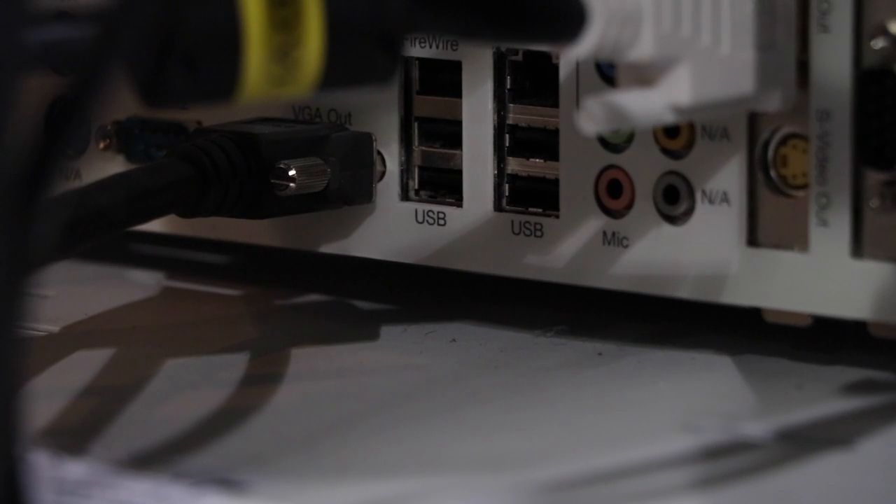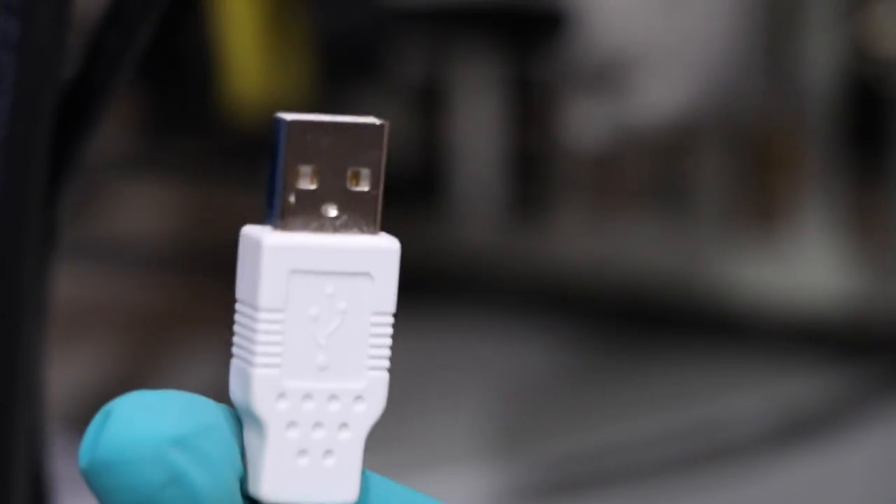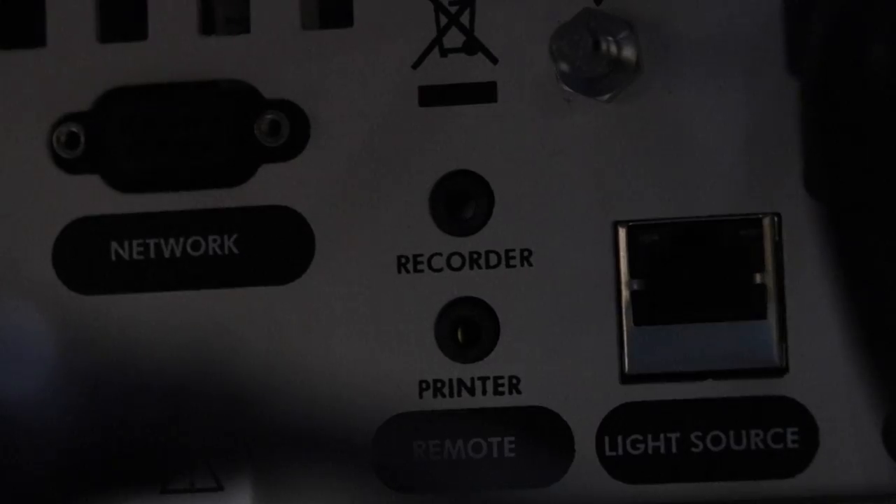Now let's take our USB keyboard and plug it in, and plug in the USB cable for the Sony printer. Once we're done with that, we'll take our remote cable and plug it into the recording printer on the back of the IM4000, and plug it into the record and capture on the DRS-HD.